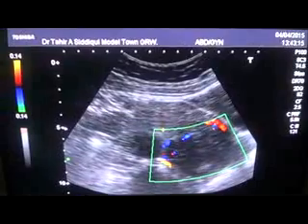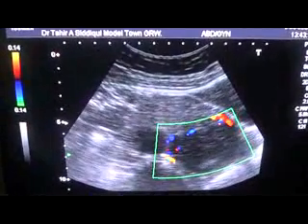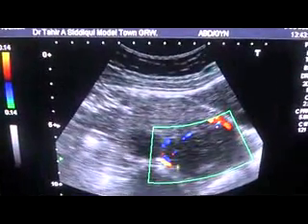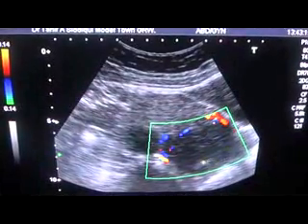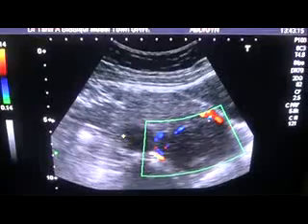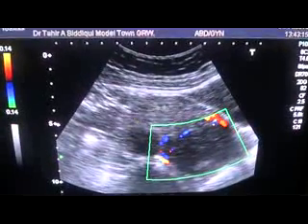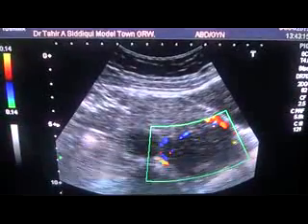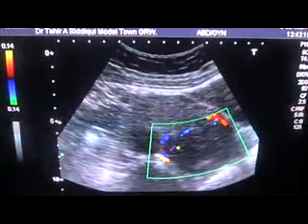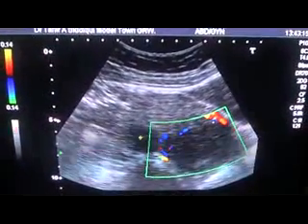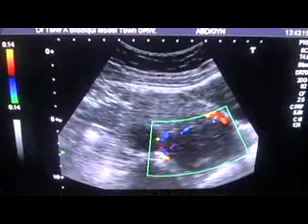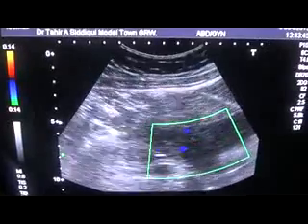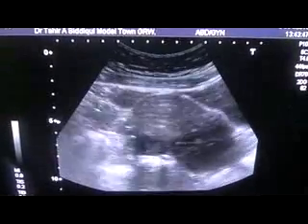This is a hypoechoic mass. This is also a relatively hypoechoic mass. This is the anterior myometrium and this is the posterior myometrium. Both are myomas which relate to the posterior wall of the uterus, lower segment of the posterior wall, with no blood flow seen in either.